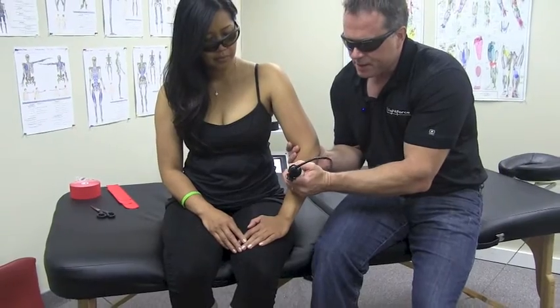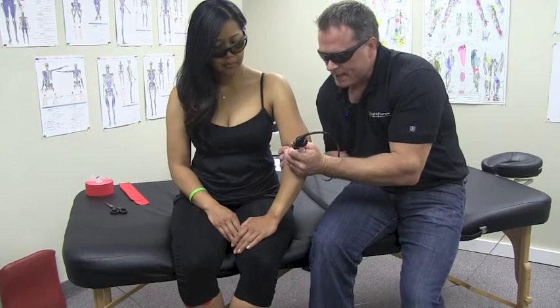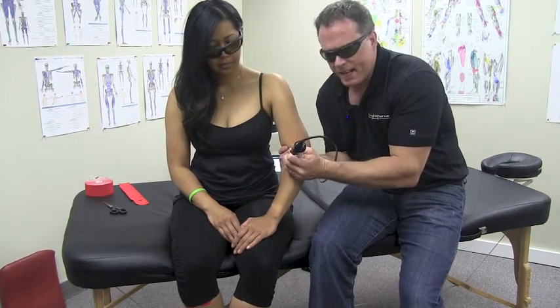You can see the difference of them doing this as opposed to that — it pushes back in and away. So this is a very great way to get feedback from the body and extra counter pressure.